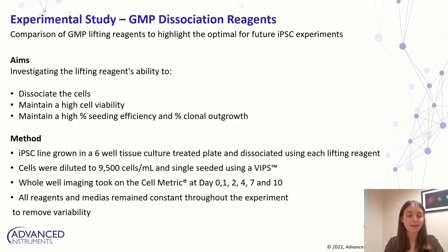So the main experimental study that I will be discussing with you is our investigation into GMP dissociation reagents. We have 3 commercially available reagents that we have been investigating, and for the purposes of this study I have named them lifting reagent A, B and C.